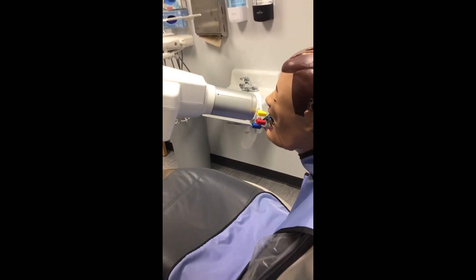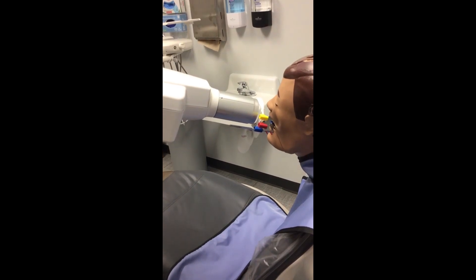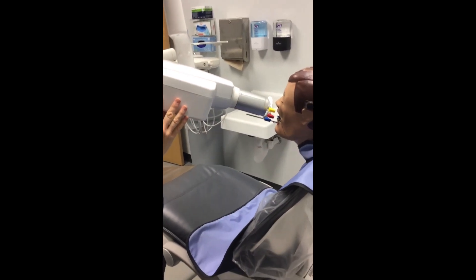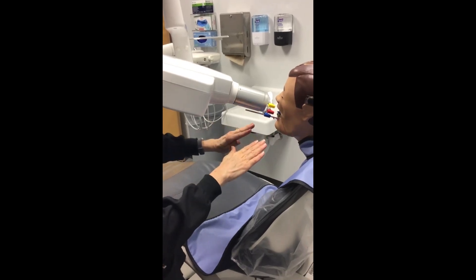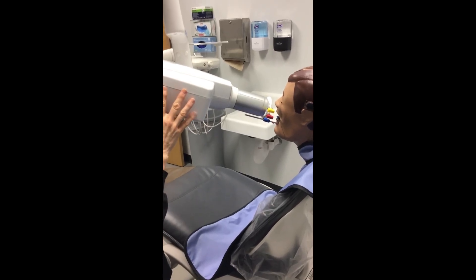One thing to notice about your maxillary projections: your tube head is pointing down. You'll see in a moment that for your mandibular projection, the angulation is more pointing up. Let's move on to our mandibular projections now.